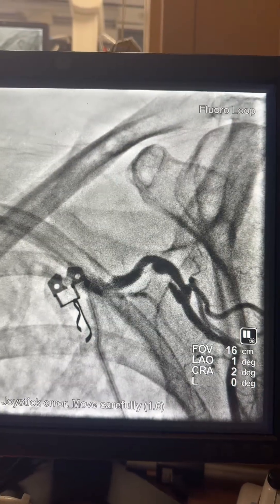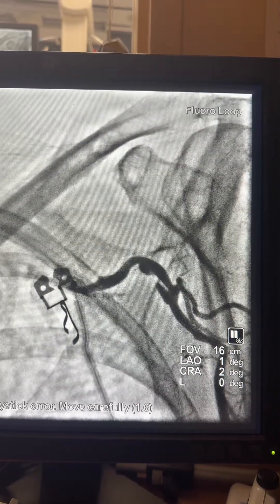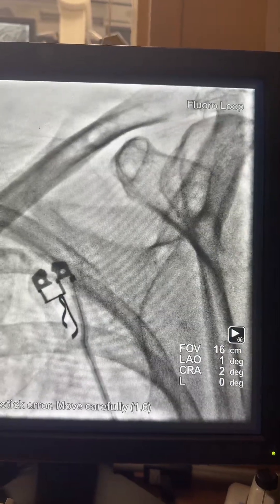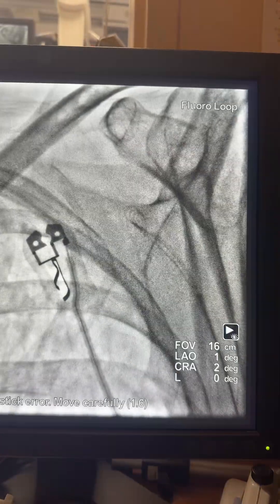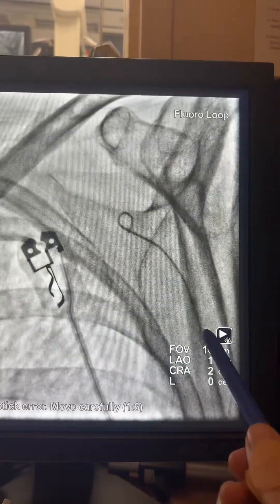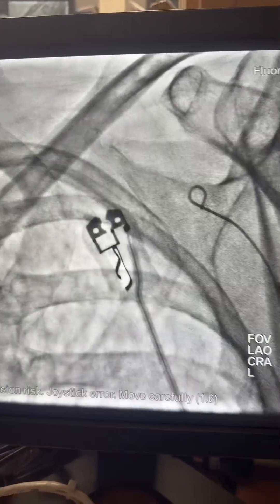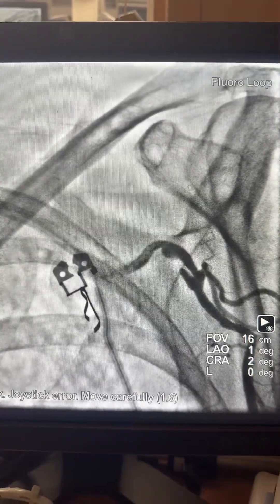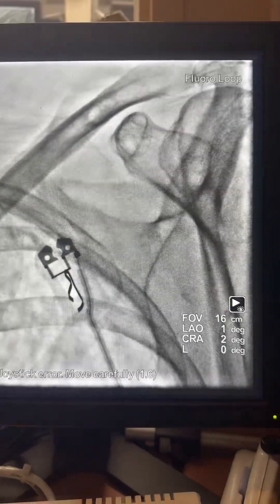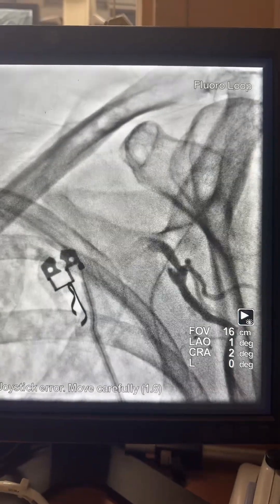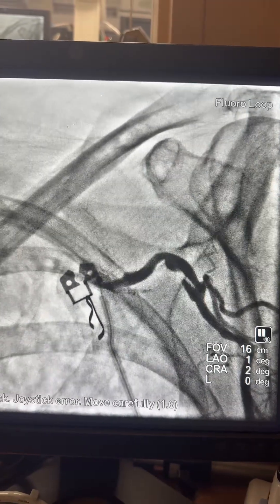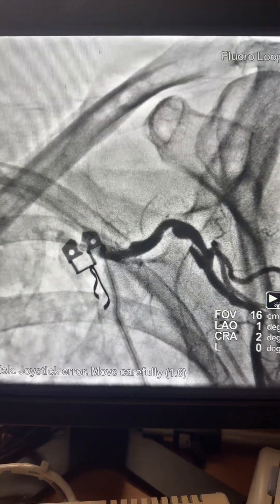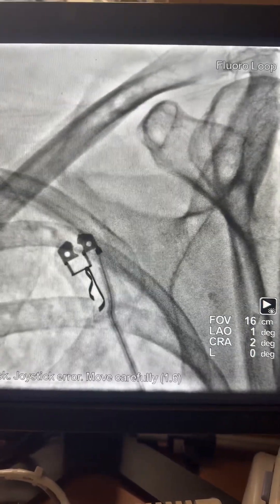Here is the first angiogram — I used the JR catheter but the JR did not pass through, so I had to pull the JR and do an angiogram. You can see the lesion here: an ulcerated plaque in the axillary artery that also extends toward the subclavian lesion, which I'll show in the next view.